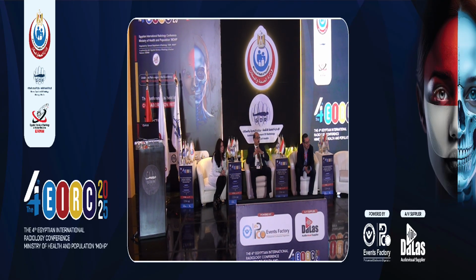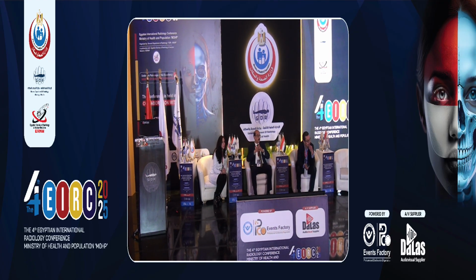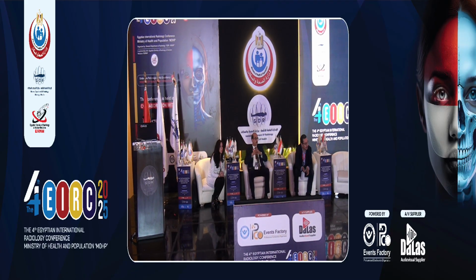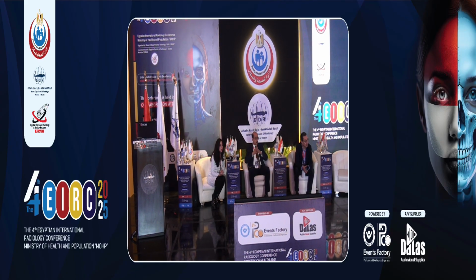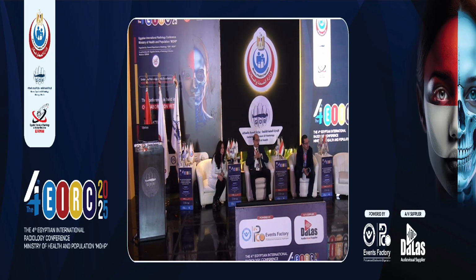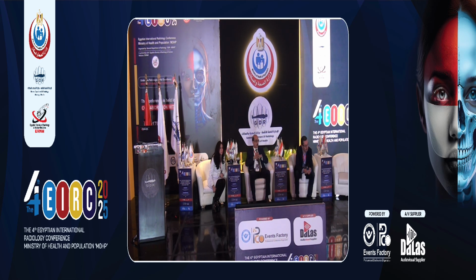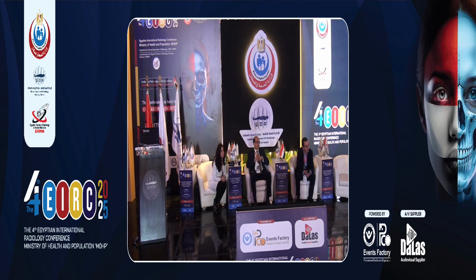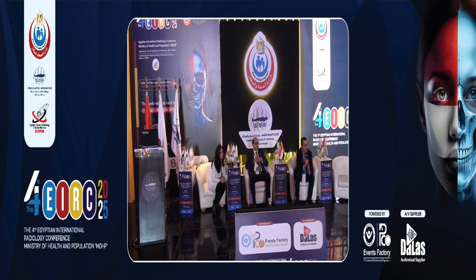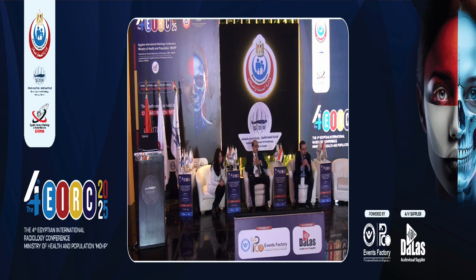After two trials with negative angiograms, I've become more inclined to place a coil proximally just to reduce the pressure head into that segment, but not really go distal and empirically embolize an artery, because the chance of this being the right artery, with all these vasa recta, is very difficult to really guarantee. But there are collaterals, so it's not going to cause ischemia, and it's coil only, no particles.